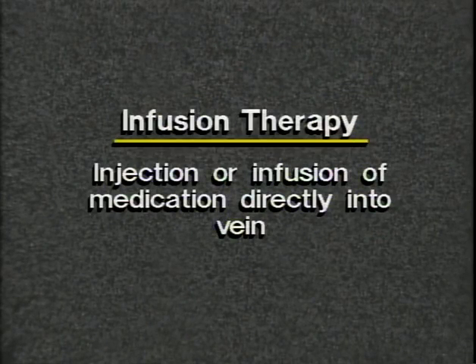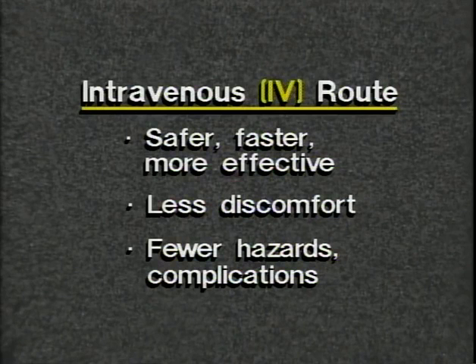Infusion therapy involves the injection or infusion of medication directly into the veins. The intravenous or IV route is a safe and efficient means of sending drugs and fluids through the body. This route of administration is faster and more effective for many medications than taking them by mouth or an injection into the arm or buttock.